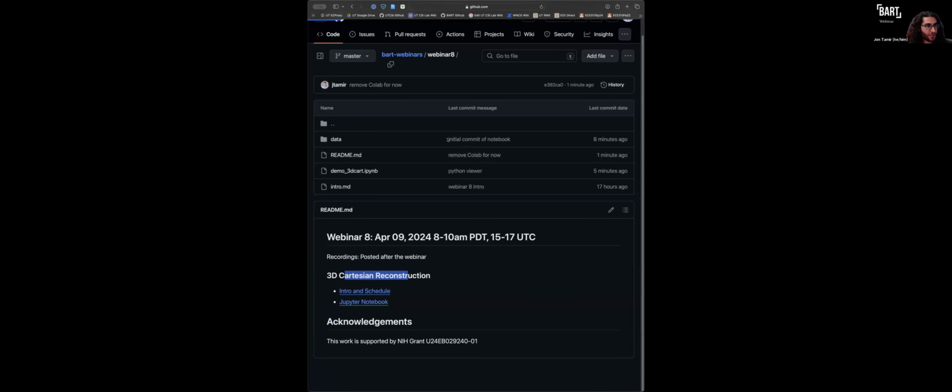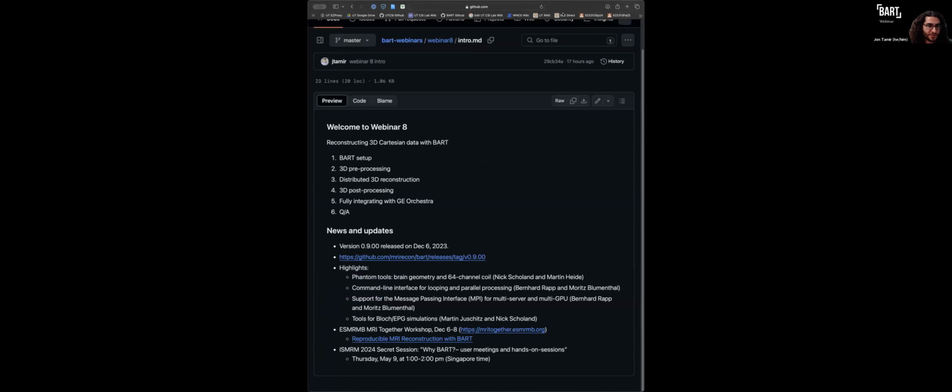But before getting in, I wanted to go over what the plan is and a little bit of an intro. So what we wanted to show for this webinar is a full processing pipeline for reconstructing 3D Cartesian data. Oftentimes we show how to use eSPIRiT and parallel imaging compressed sensing, but there are typically pre-processing steps that you have to do beforehand, as well as post-processing. And in many cases, the end goal is to end up with DICOM images so that you can compare it to some standard of care reconstruction method.